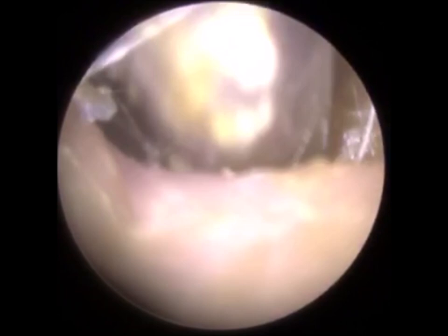Just see there how it's just sprung back. I got a grip and it literally just sprung back. And again, you can see some contact bleeding. We've not done anything there, we've not cut into the ear canal. It's just as the skin elevates. In a way, it's a reassuring sign for me because it means that I have loosened some more skin of the canal wall, hence the bleeding.